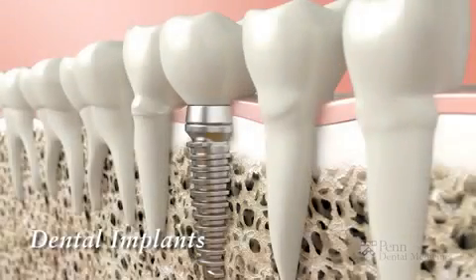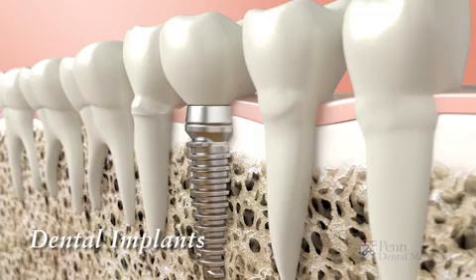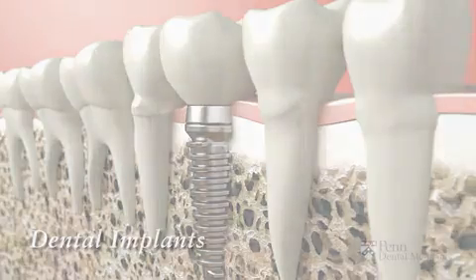Perhaps the development of the modern implant has revolutionized the practice of dentistry in recent years more than any other innovation. While dental implants were being placed as early as the 70s, the osseointegrated implant became popular in the 80s. In 1952, an orthopedic surgeon noted that he could not remove a small titanium cylinder he had placed in a bone to study how the bone healed.